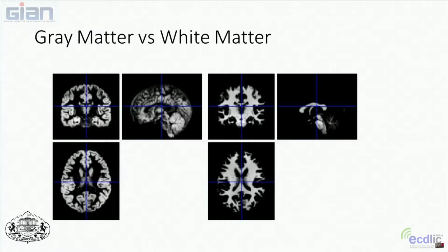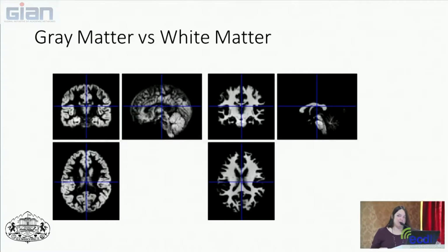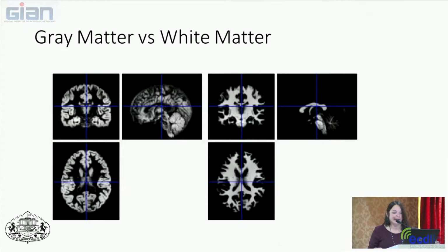And this is actually some brain images from one of the studies that we do, and you can actually take the slice of brain image and break it down into gray matter and white matter. And you can see really how much white matter you really have inside your brain on the right-hand pictures there. The left-hand pictures are the gray matter, which we're going to talk a little bit more about when we talk about neuroanatomy. But it's this white matter that really allows for really rapid communication between the cells.